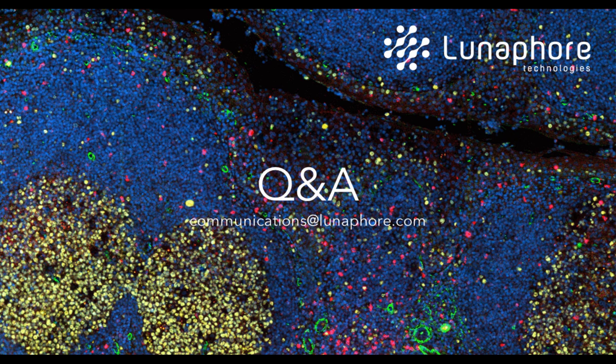Excellent. I see more questions coming in. This is great. So please go ahead. We have another question asking, can we identify intracellular markers? Yes, we have data showing that we can detect all types of markers: membranous markers, cytoplasmatic markers, and nuclear markers. We have, for example, optimized FOXP3, Ki67, etc.